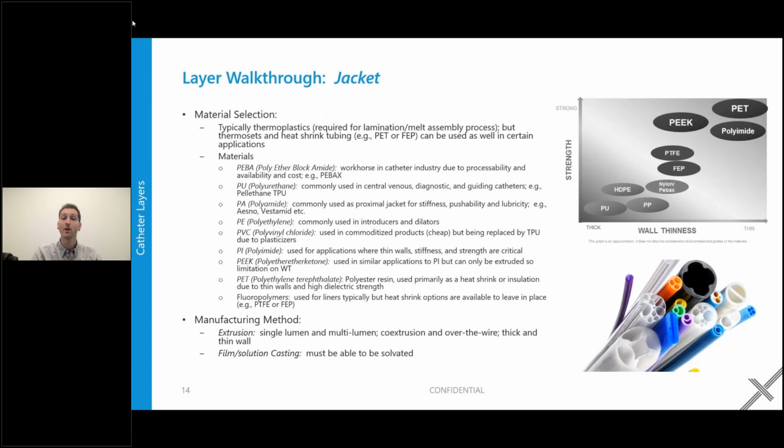There's polyurethanes, PUs, also known as TPUs. So these are thermoplastic polyurethanes. There's benefits to using thermoplastic polyurethanes, especially in the lower durometers. The problem with PEBAX is it stops at 25D, which is about 80A. But the 25D material is very sticky and does not perform very well. So that's where you're going to start thinking about switching to a polyurethane if you want to go softer than that, or get a little bit better performance out of that 25D, 80A range material.